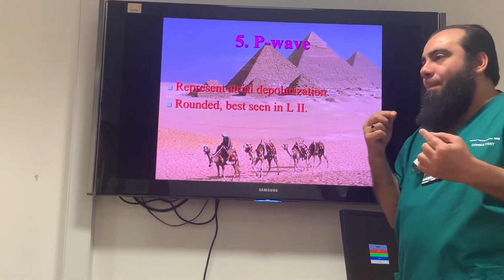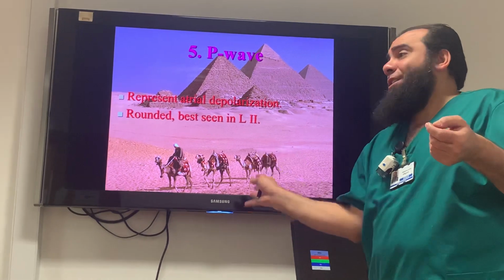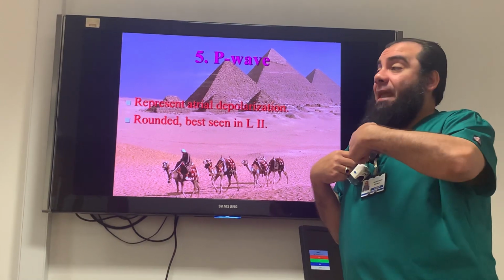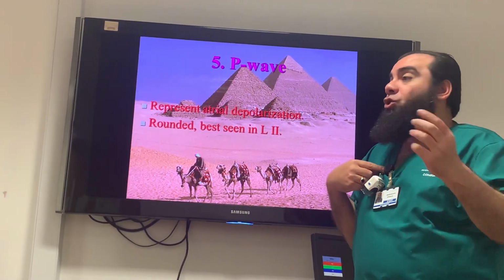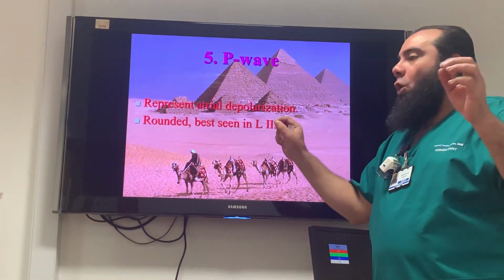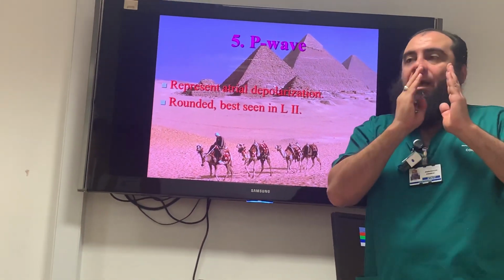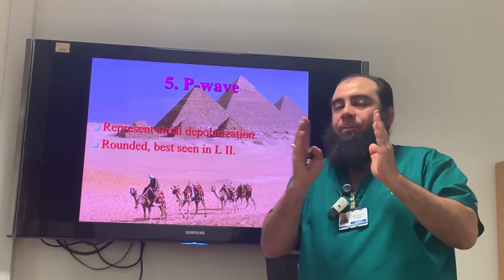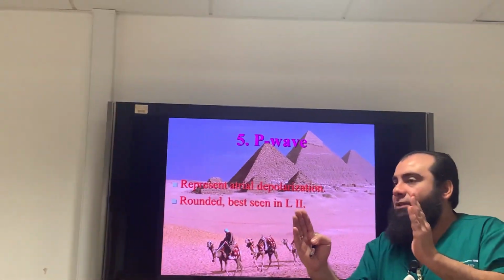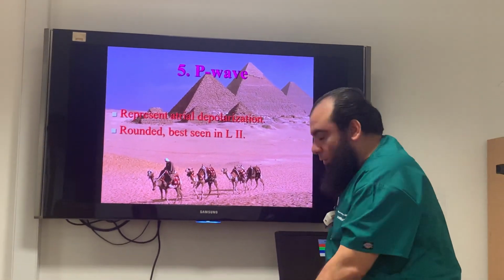Well, they don't always. It is a tiny contraction, not like the ventricle. It starts at the right atrium, and has access to the left atrium, and goes quickly. They are supposed to work together simultaneously, but there is a slight delay, which gives us an idea about the P wave: approximately the first half is right atrium activity, and the other half is left atrium activity. It's important information because it's going to affect the changes I'm going to discuss later.